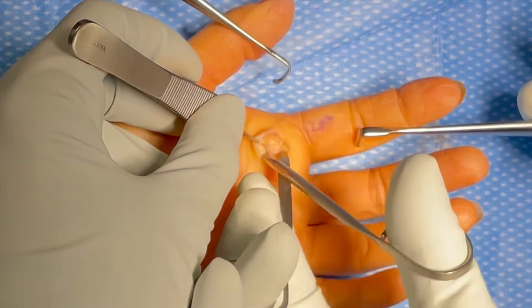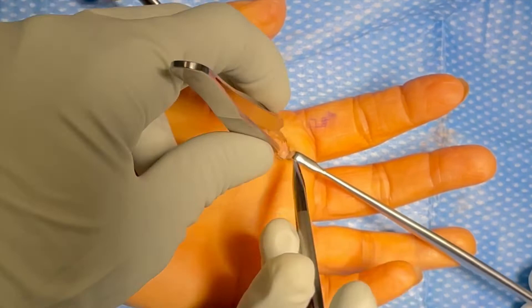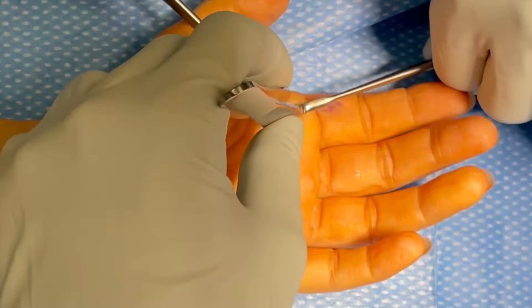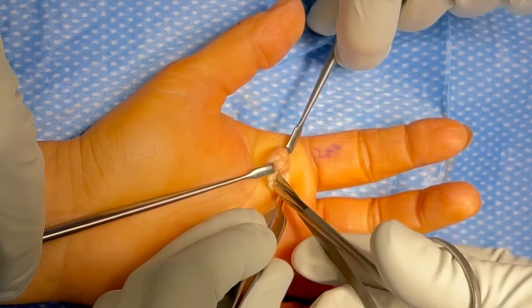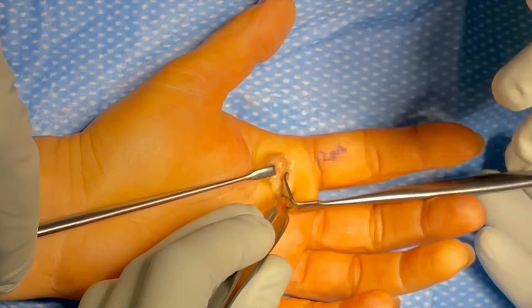In general, this tumor tends to have an orange or brownish glow to it from the hemosiderin staining the tumor itself. At this point we're carefully dissecting around the mass, separating it from the surrounding tissues including the subcutaneous fat and the underlying tendon sheath and A1 pulley. We're using Ragnell retractors and Adson forceps to help hold tissue and dissect carefully, taking great care not to disturb the mass and to remove it all as one piece without spilling any tumor cells into the surrounding tissue.